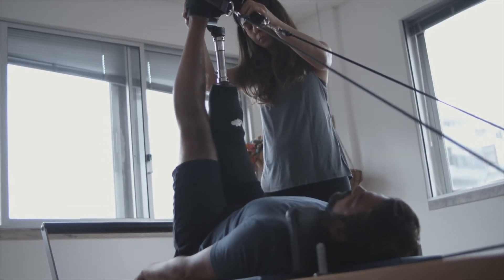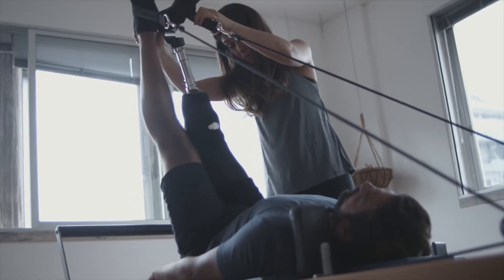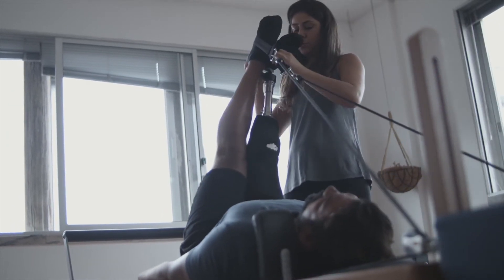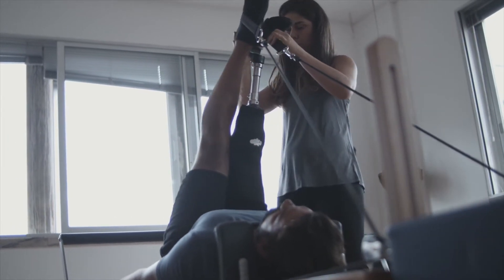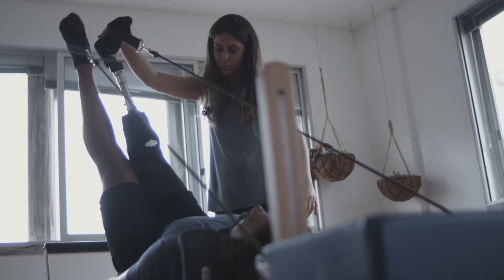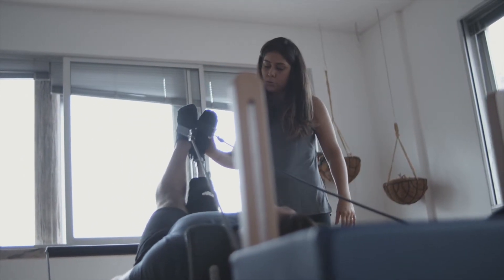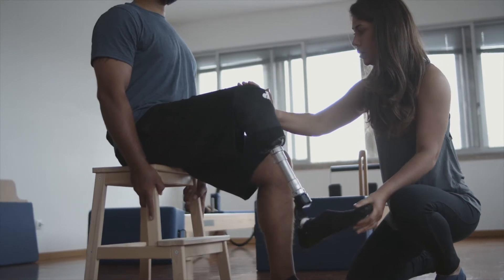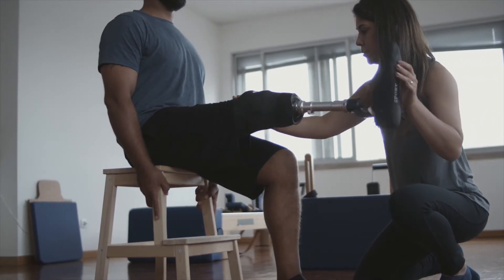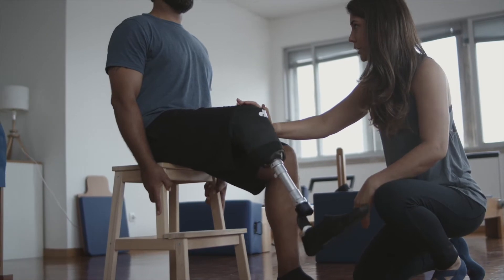Rehabilitation refers to enhancing or restoring the movement and quality of life for people with disabilities or other impairments due to diseases or injury. However, doing repetitive tasks for long periods of time is daunting and less intensive than needed for proper treatment.